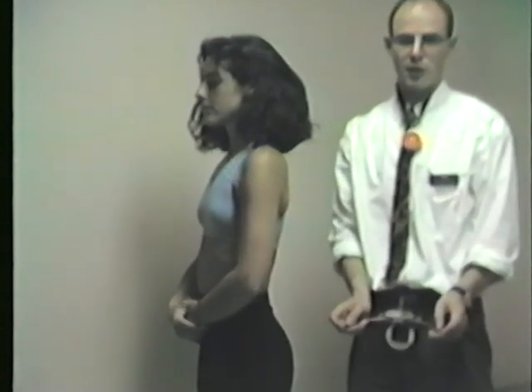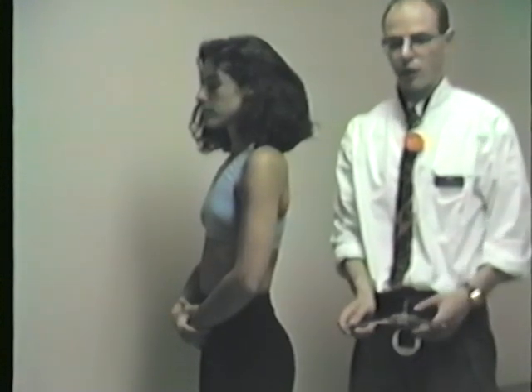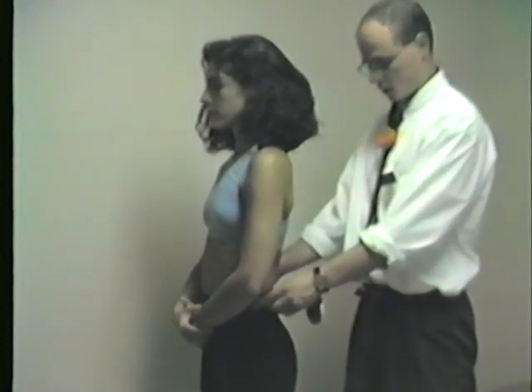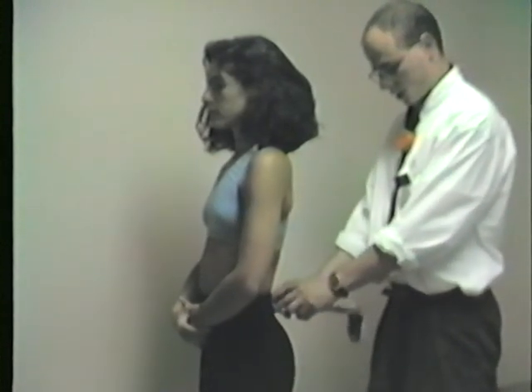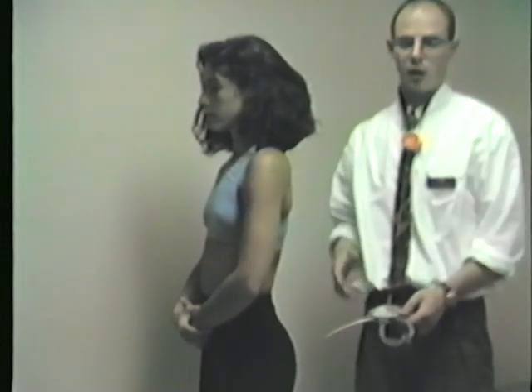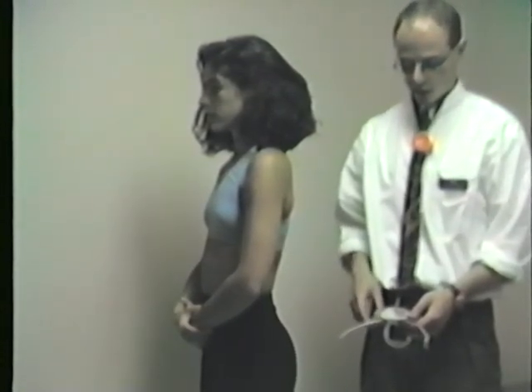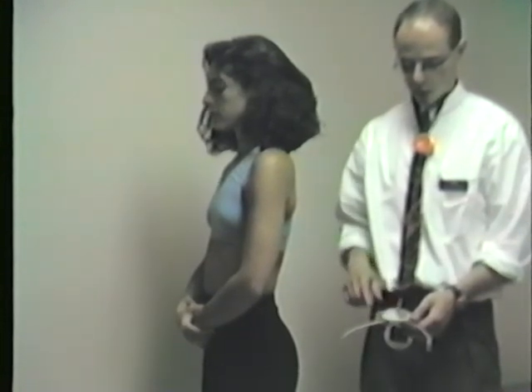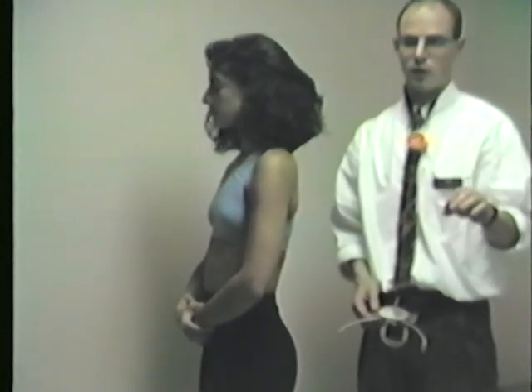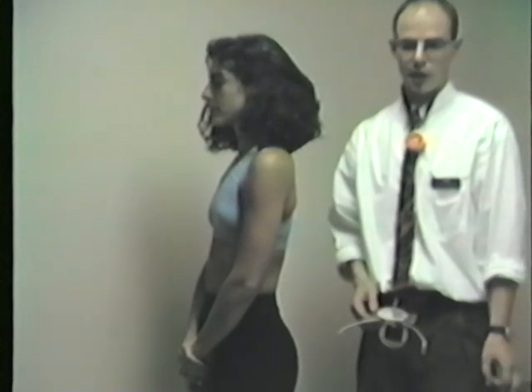Now, if I want to measure if one iliac crest — or the PSIS, or the ASIS — is elevated, to see if there's a leg length discrepancy or to conclude on an anterior rotation of one ilium, I can do this as well. So I can contact the iliac crest, or I could contact the PSISs. The advantage of this tool compared to the pelvic levels that you see in some physical therapy practices is that I know the inclination exactly, I know the angle as well as the distance, and so I can calculate exactly how many centimeters one point is higher by using the trigonometric formula — multiplying the distance by the sine value of the angle.